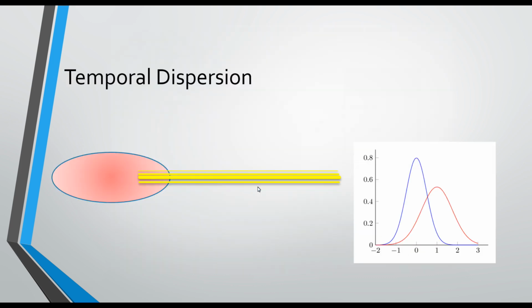And so in the normal situation, you have a standard distribution effectively of those nerve fibres, some conducting a little bit faster if they're larger and more myelinated, so they'll be sending their signals the fastest, and some of them will be slower because they are smaller in diameter and less myelinated, and there'll be a whole cluster around the middle. And this is essentially how you have these curves that we see with the sensory nerve action potentials, and similarly also with the motor action potentials too.